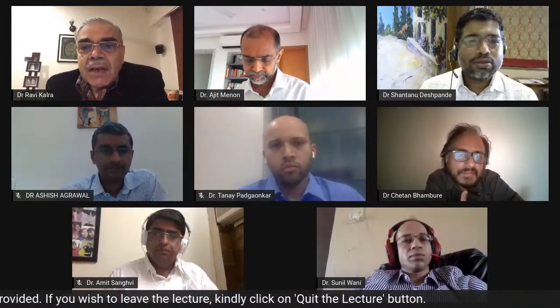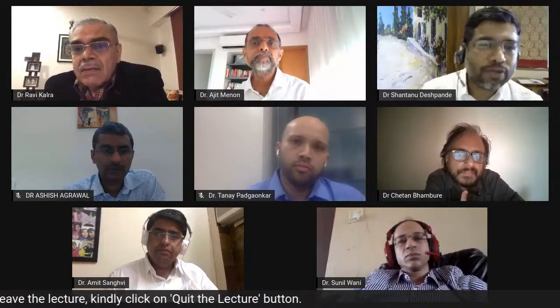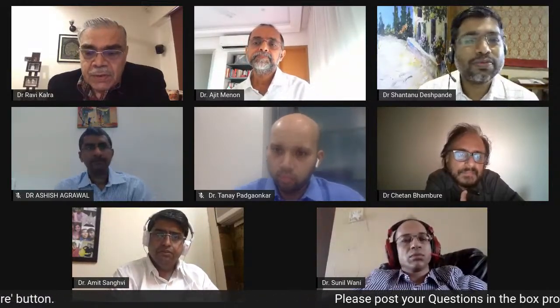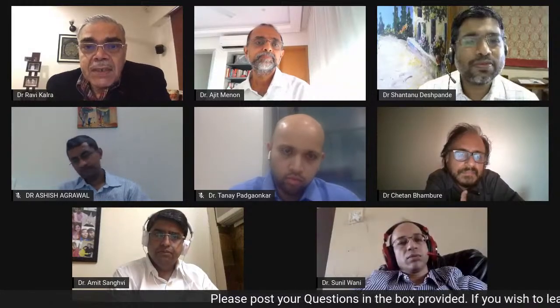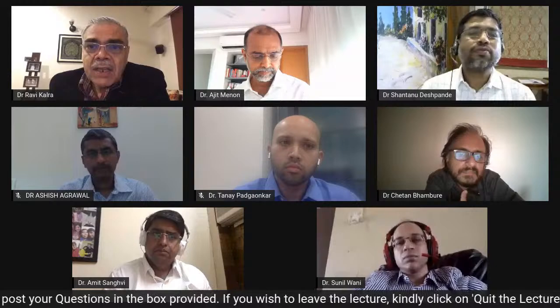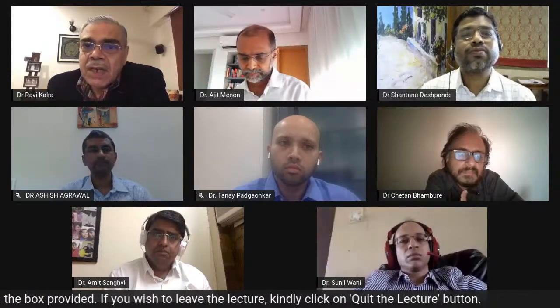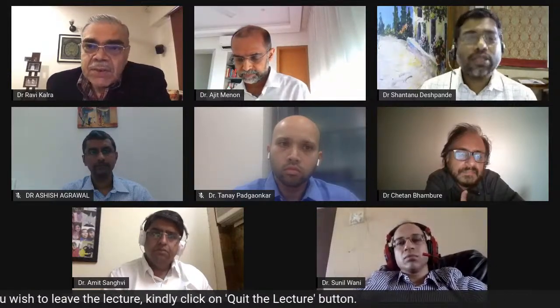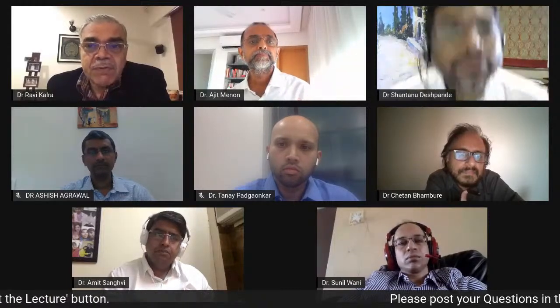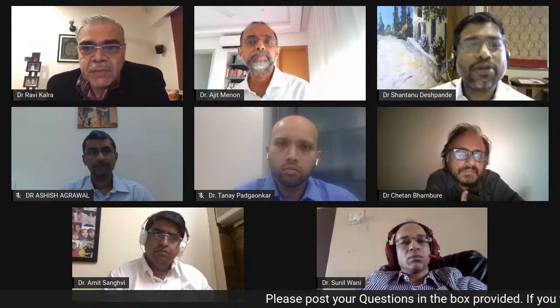So what's the percentage of usage of thrombosuction catheter in your practice, Dr. Kalra? I use it a lot when there is a large thrombus burden. As Dr. Menon already said, it's all on the table. If you see that there is a thrombus burden, I will use it. And when you have to use thrombus suction, I prefer the 7 French thrombuster rather than the 6 French.